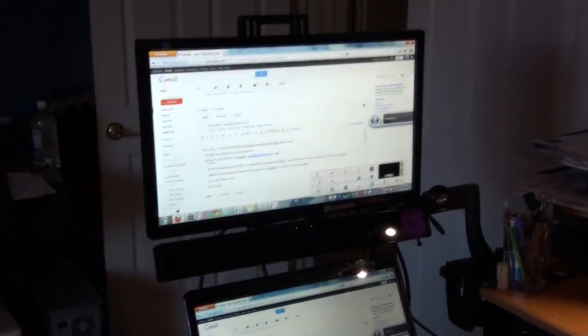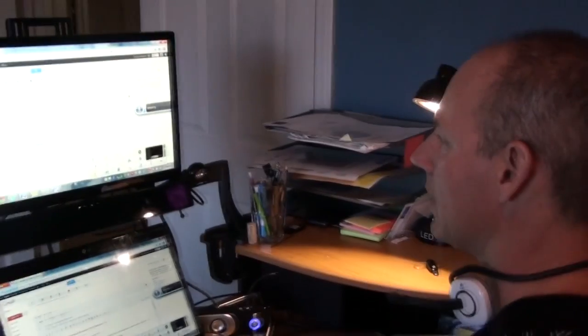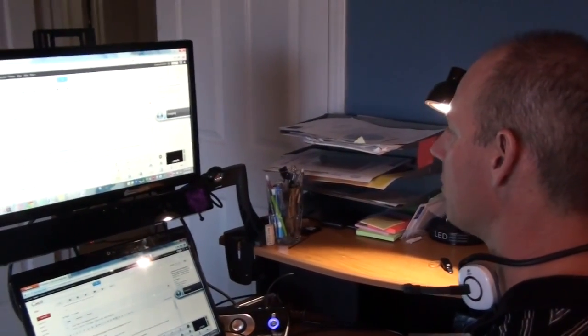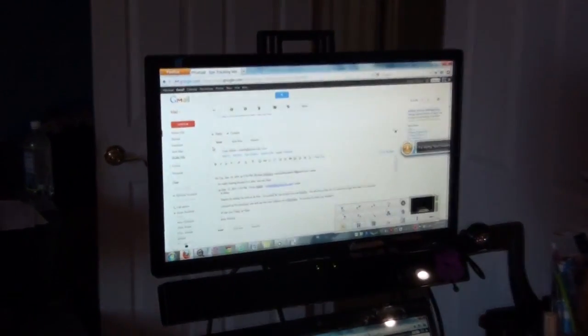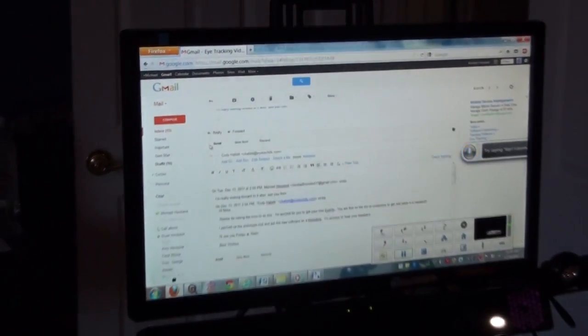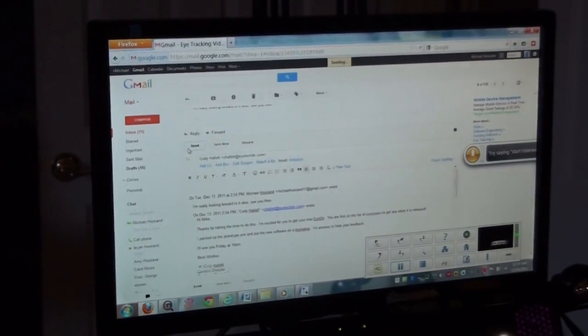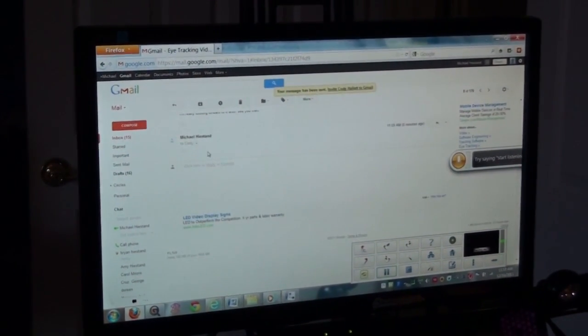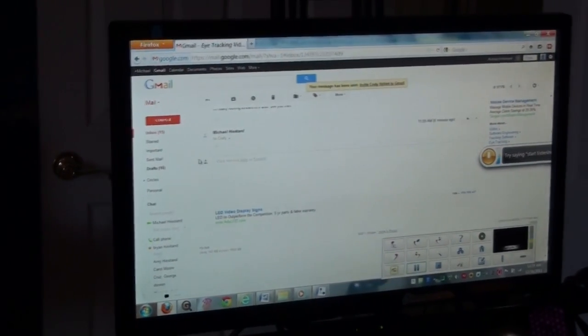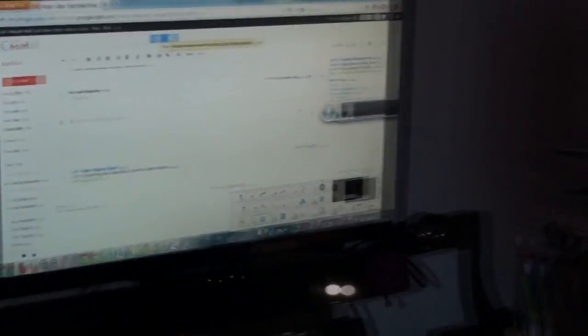I just hit insert, and then it puts everything into place for me. And there's everything that I just dictated. And it's right there. So then when I'm done, I just look up at the send button. I click send, and that's it. Cody will get my email, and I never had to touch my keyboard or my mouse one time.